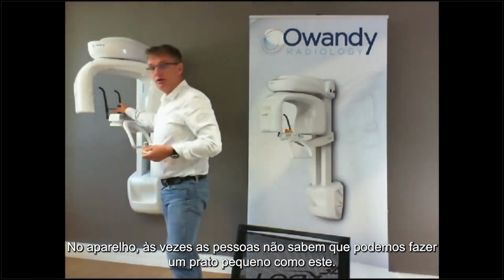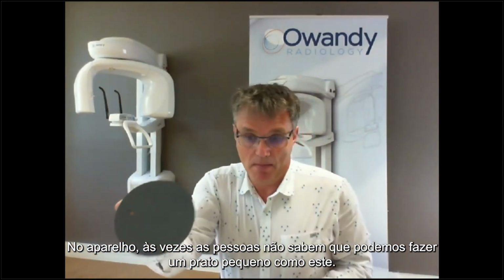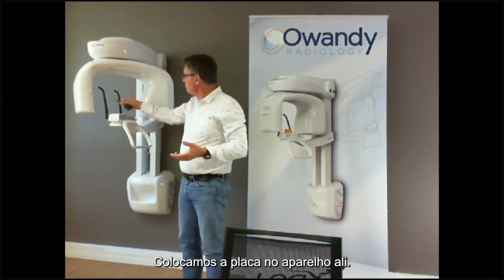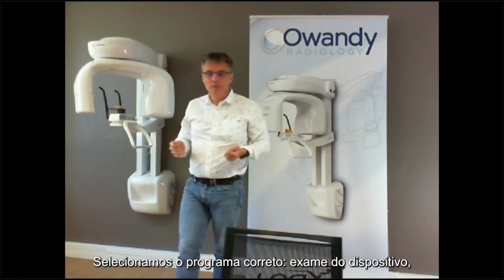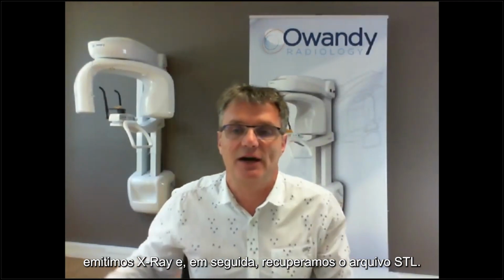Well, it's very easy. On the device, sometimes people do not know that we may use a small plate like this. We just put the model on the plate. We put the plate on the device itself. We select the correct program, exam from the device, and we emit X-ray. And then we retrieve the STL file.